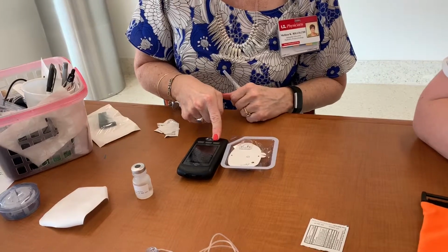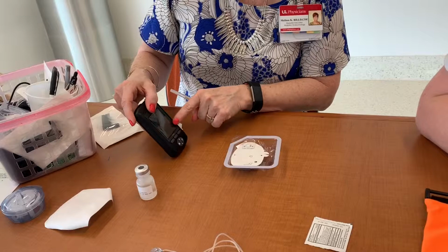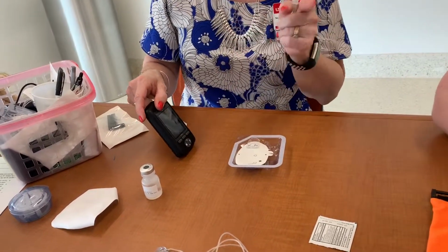I'm gonna press and hold my little home button for 3 seconds. And it's saying, do you wanna activate a pod? So I'm gonna say yes. And then it tells me what to do. And the new remote will be this way too.